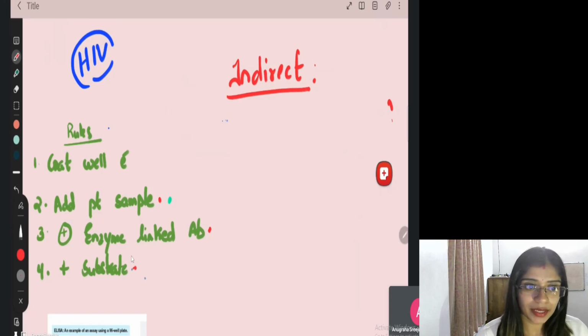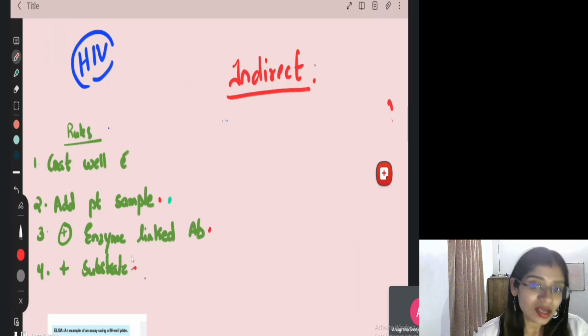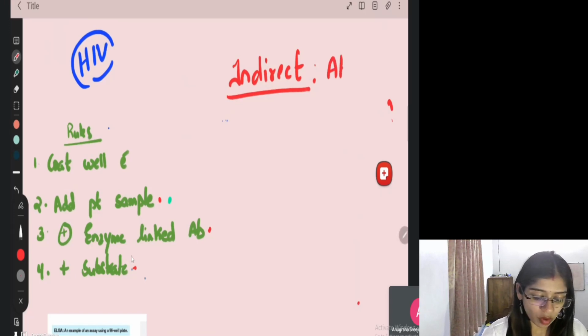Indirect ELISA. So the final two topics, indirect ELISA and competitive ELISA, will finish off in hardly 5 to 7 minutes. So what is indirect ELISA, guys? What are we trying to detect? You know the basics. We are trying to detect the antibody of a patient.